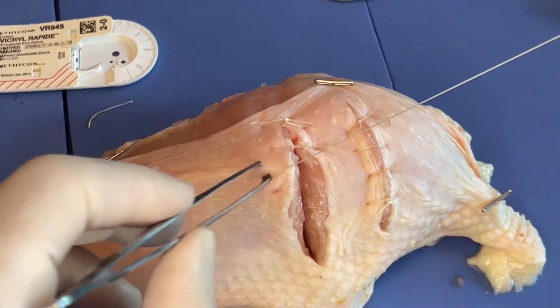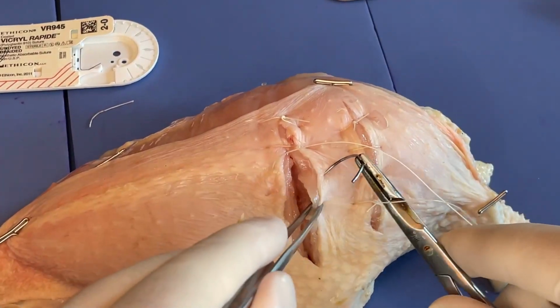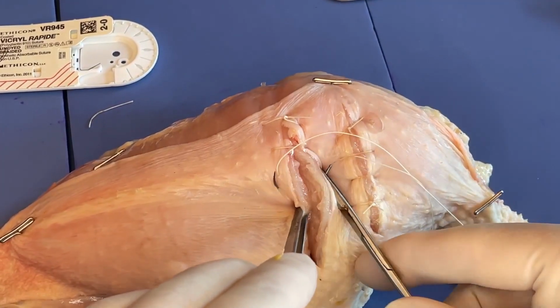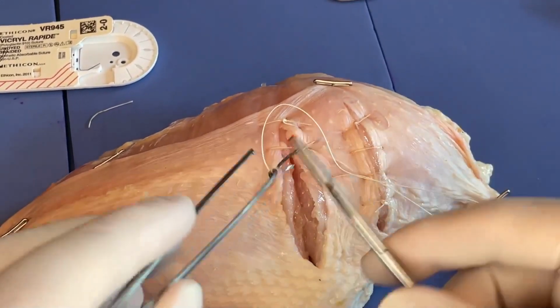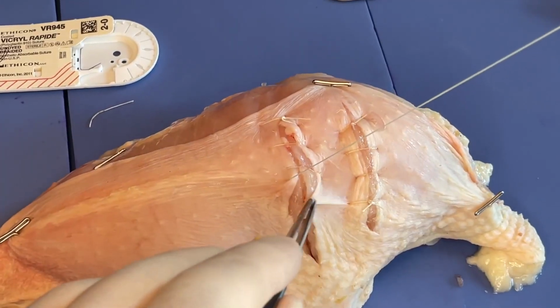And pull that through. And then we just keep doing that. So in here, come out in the middle so I see my needle tip, can control exactly what depth of tissue I'm going down through, curve that out, reload at the tissue, and pull that through.